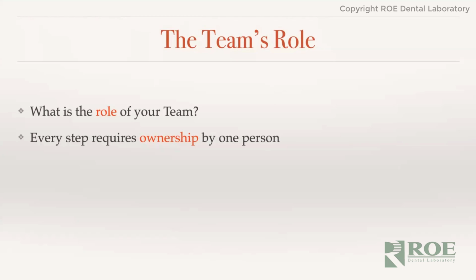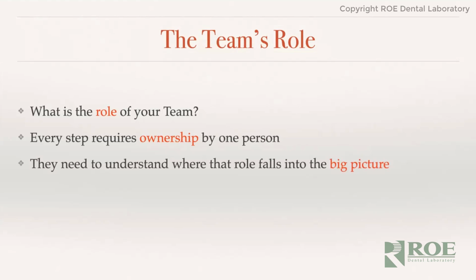They need to understand the workflow for every procedure that's being done, and they need to know that responsibility. They need to have responsibility for what they do, and they have to be able to pass on that responsibility from that procedure to the next person on the team. So they need to see where their role falls within the bigger picture of all this. They need to understand how every one of these procedures works and the goals of that procedure, whether for a single anterior unit or an overdenture or the fixed implant prosthesis.